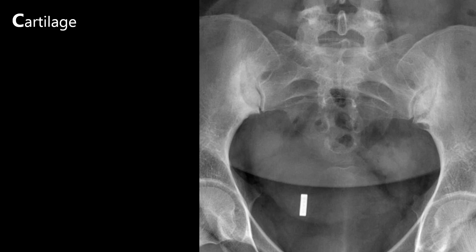This x-ray shows subchondral sclerosis around the sacroiliac joints bilaterally. This is sacroiliitis, which means inflammation of the sacroiliac joints. It's a common cause of lower back pain and can be caused by arthritis, a traumatic injury, and sometimes infection.